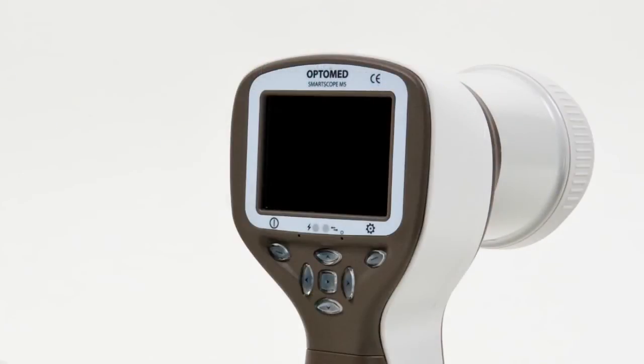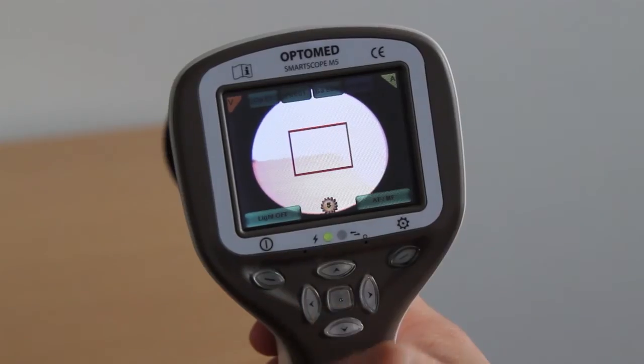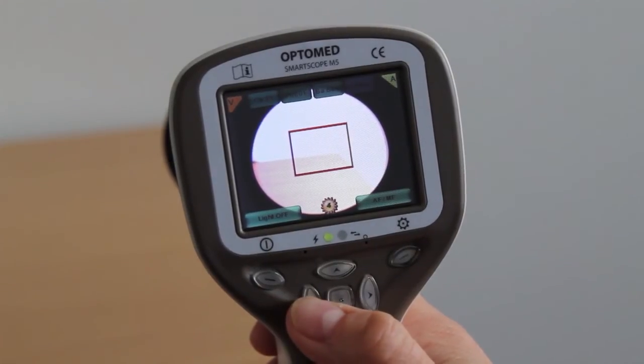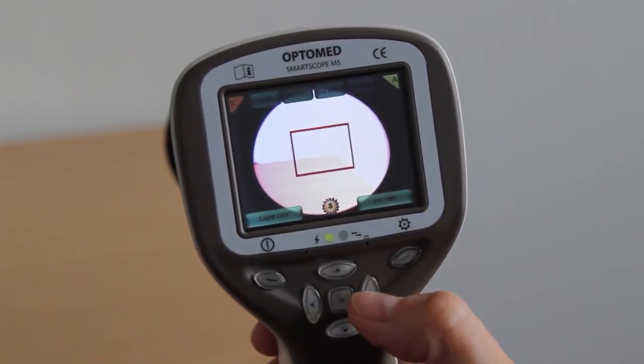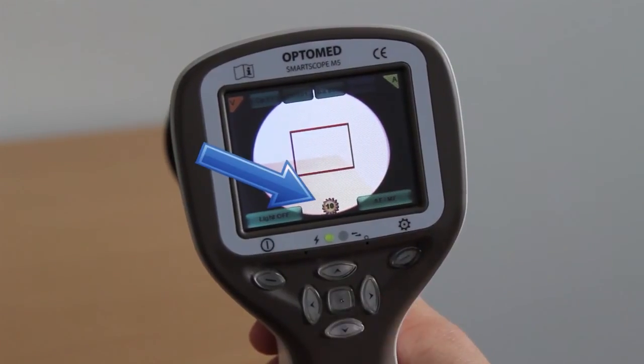Illumination. Activate illumination by pressing the shutter button halfway down. Adjust the level of illumination by pressing the left and right arrow keys. The graphical icon on the bottom of the screen indicates the brightness level of the illumination.